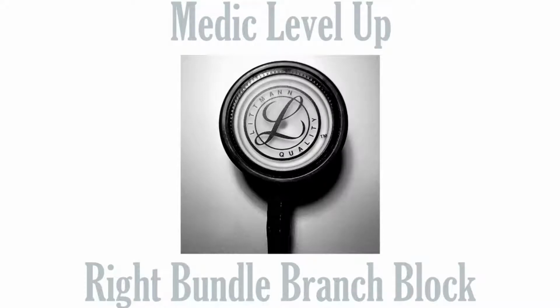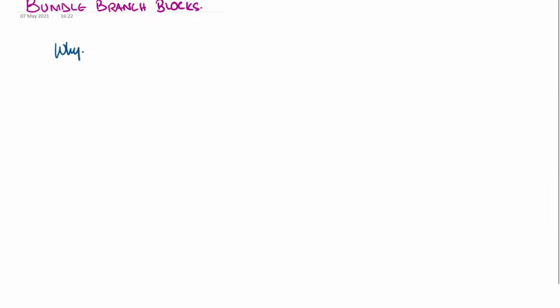Today's video is going to be about a right bundle branch block, and successively we're going to be studying about a left bundle branch block and fascicular blocks as well. The first question that comes to mind is why study about a right bundle branch block?